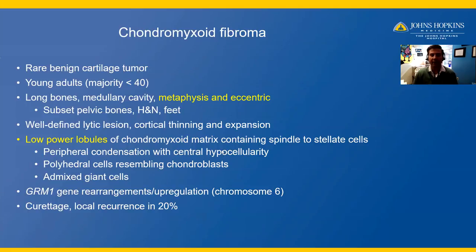Remember to stay at low power for this tumor. There is often an admixture of giant cells in addition to the bland spindle cells. Molecularly, it has been identified to have a GRM1 gene rearrangement with downstream upregulation on chromosome 6.